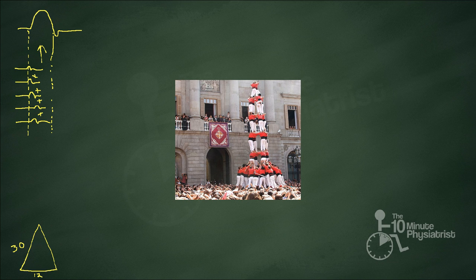Now, there are actually 3 things that we could do to this potential, or these people could do to their potential to change it. The first thing would be for everyone to move to the right. If all the people on the base of the pyramid took tiny baby steps over to the right side of the screen, and they managed to hold their balance and keep the pyramid completely intact, and they move 10 feet or so, what you would find is this pyramid would be physically moved over to the right, but it would still be 30 feet tall, and it would still be 12 feet at its base. So that principle is that the movement, or by way of analogy to the EMG, slowing of fibers, if all the fibers move the same amount, if they all slow to an equal amount, then the morphology of the action potential doesn't really change. You still have a 30-foot high, 12-foot wide pyramid.